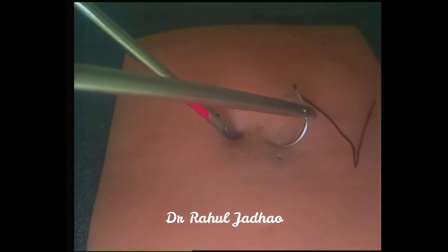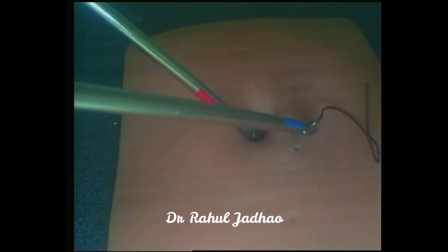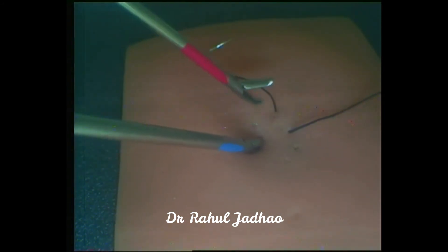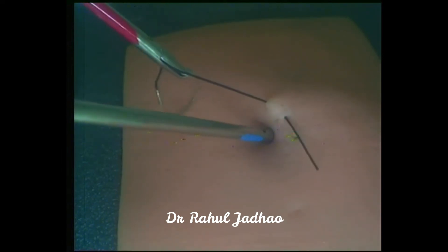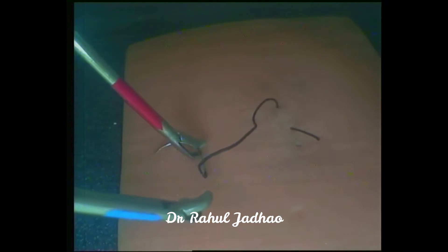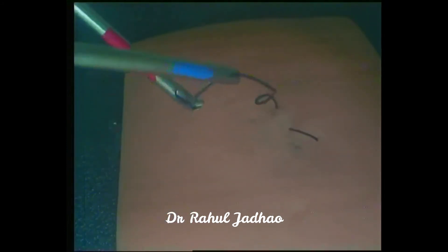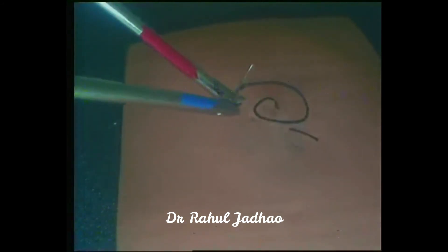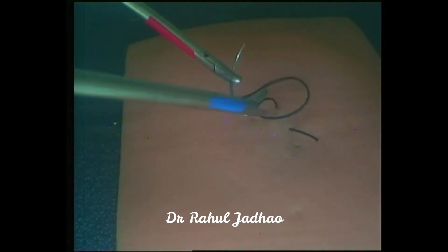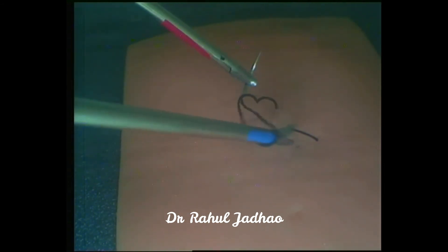First, the needle is passed through the silicon suturing pad, and the suture length for using this technique should be just 10 to 12 cm. Now the needle is positioned in the smiley form.